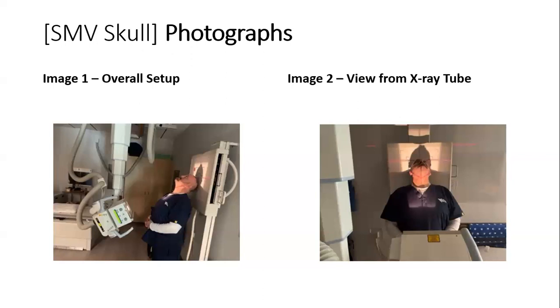I collimated the beam on all four sides to get the anatomy of interest. I placed the marker on the right side of the grid. The instructions for the patient for this exposure is suspended respiration.